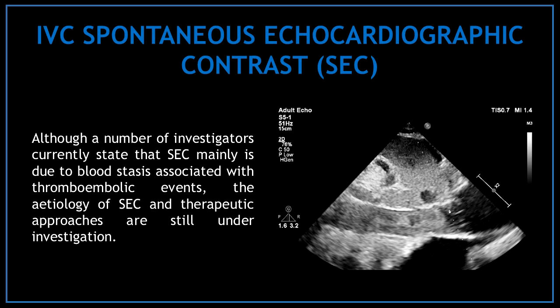Although a number of investigators currently state that spontaneous echocardiographic contrast is mainly due to blood stasis associated with thromboembolic events, the etiology of spontaneous echocardiographic contrast and therapeutic approaches are still under investigation.